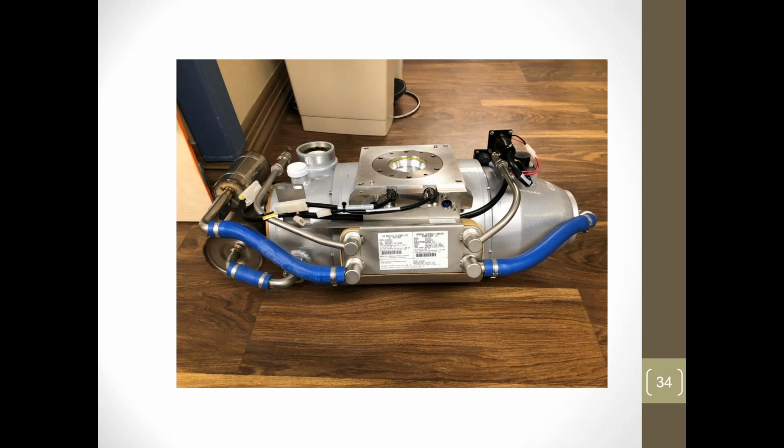Then here's the tube without anything on it. For those of you that have been in X-ray, here's your cathode, and then your anode's tucked back over here. These guys here weigh about 250 pounds. So not fun to mess with if they don't behave themselves.